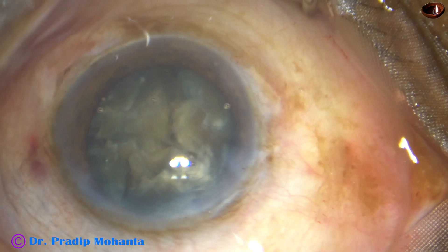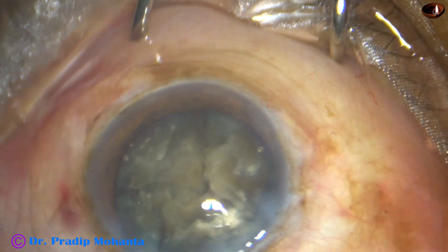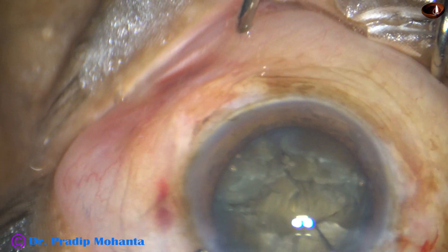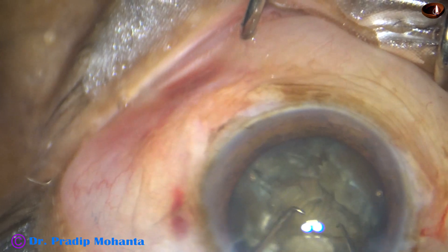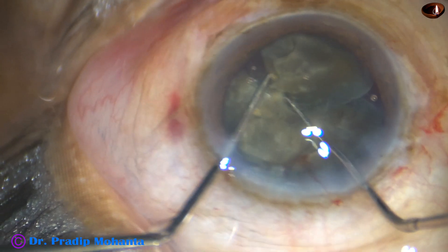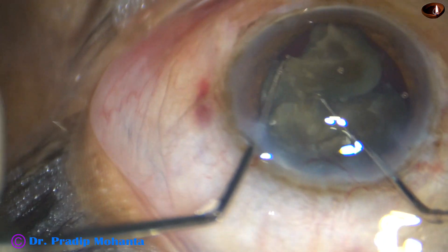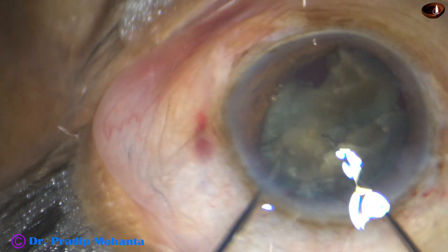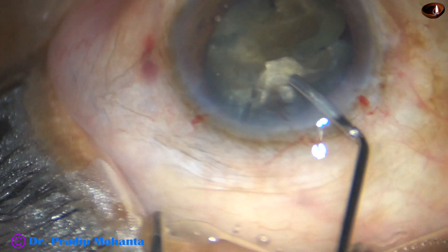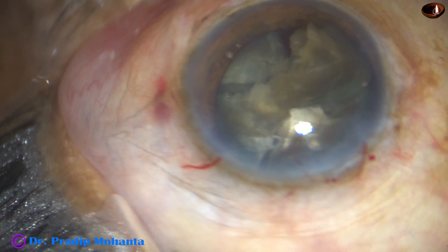So I have to do something else. I came out, injected viscoelastic, and now I am taking a sinski hook in my right hand and the chopper in my left hand. I am trying to find a fragment — yes, this one. I went from behind and only one fragment has been made free. The other three fragments are still joined to each other by the stubborn posterior plate.